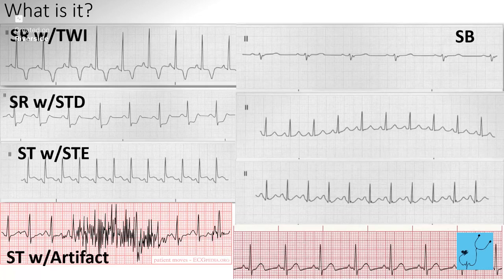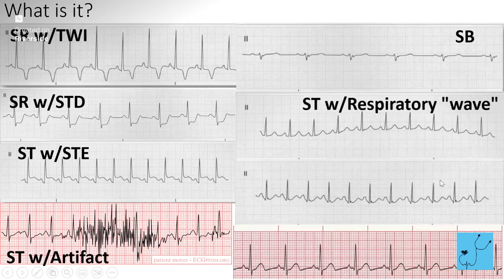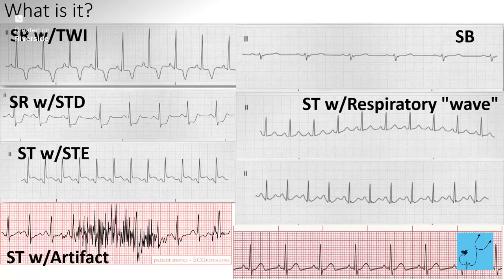What about this? Say that again? Yeah, sinus tach. And what do we see here? What is this thing? It's that respiratory breathing, right? The breathing pattern a little bit. Okay, and then second to last. And the last one. Yeah, it's just sinus. Good.